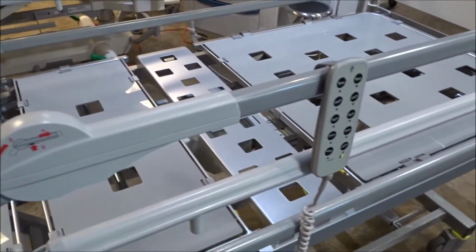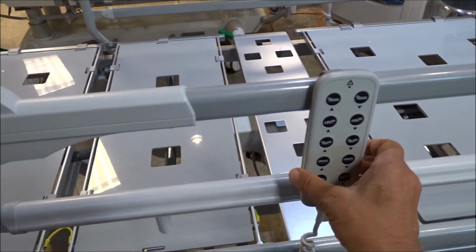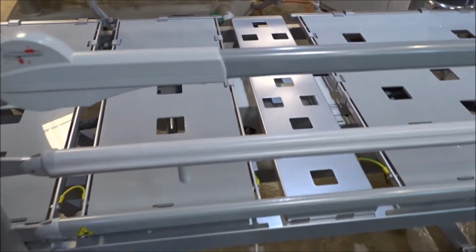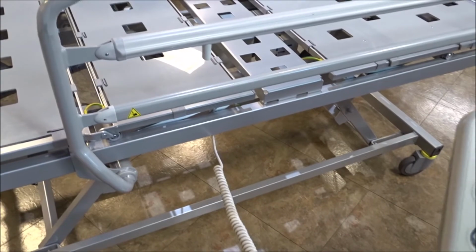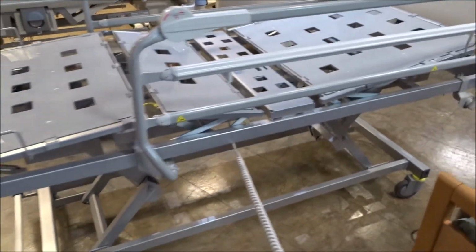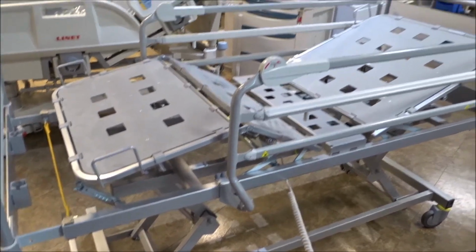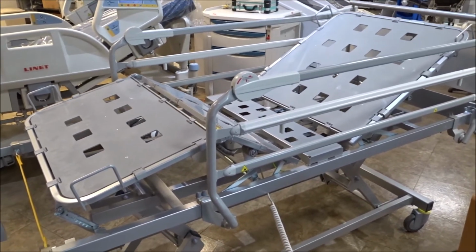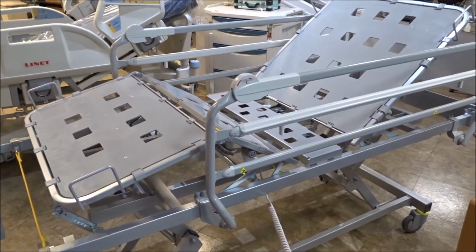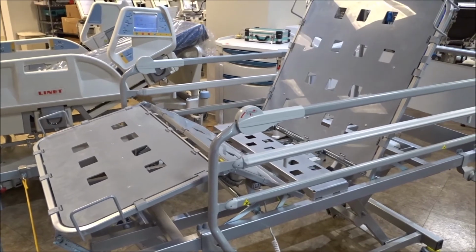One thing that people do also with high-low beds, because that is for risk management for people falling out of beds, they drop them down. Like I said, it's just 12 inches off the ground. And when it's 12 inches off the ground, you can put another mattress next to the bed. So if somebody does roll out of bed, all they're really doing is rolling out onto another mattress, which is something that we've seen other people in hospitals and places do in the past.